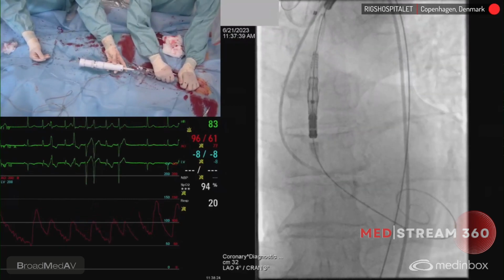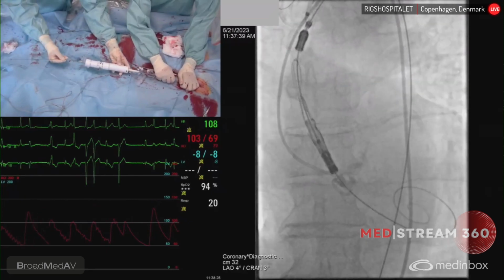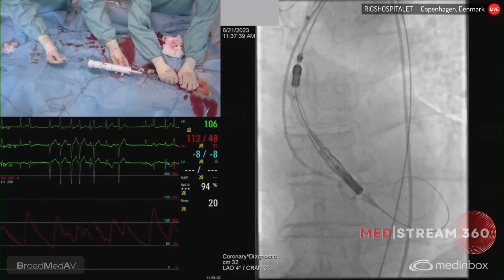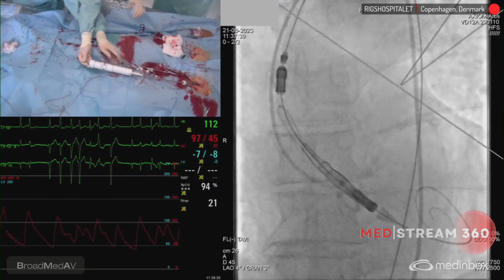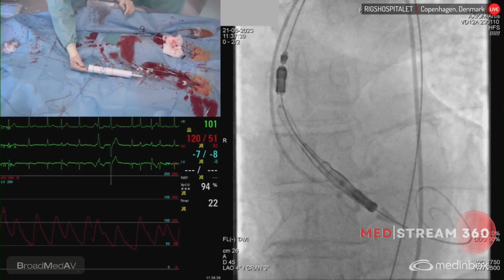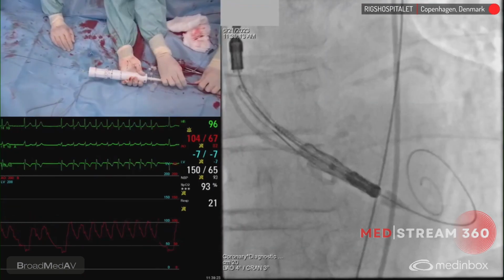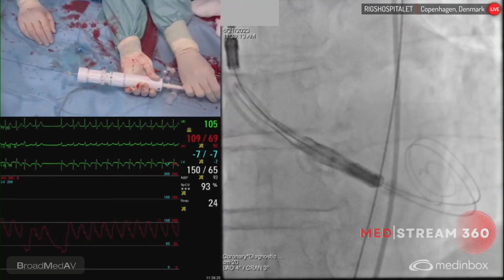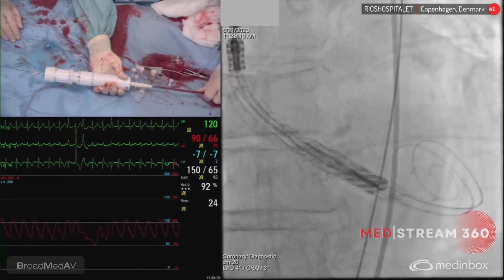Valve is correctly loaded. It's a good thing. Okay. I think I will step in if I'm here. We have to be very precise here, I think. Let's try to do that. Patient has to lay very still too. It's important. All right, good. I'm almost there where I want to be. I wouldn't go lower than this for sure, I think. So we check it.